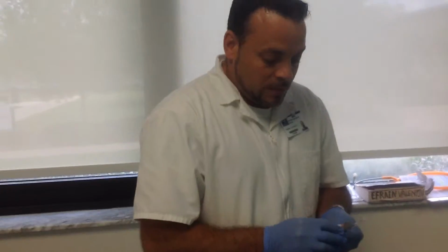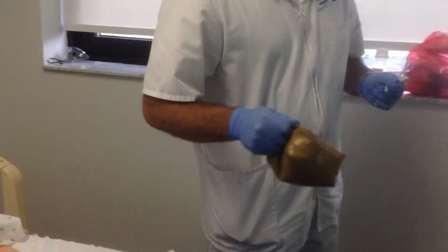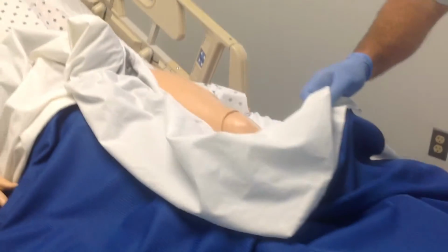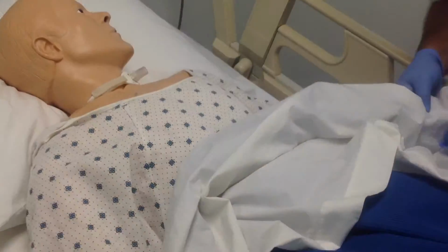Yes, we would have to remember always when giving these medications that we have to check our 6 rights, which is the right patient, the right drug, the right dose, the right time, the right documentation. And those are the rights that we need to check, and we would cover our patient up. All this stuff can go in the sharps container, except for the alcohol swabs. We will cover our patient up.